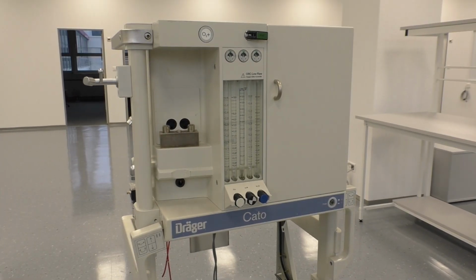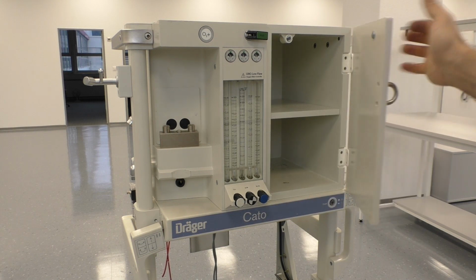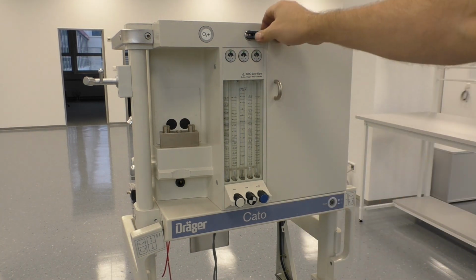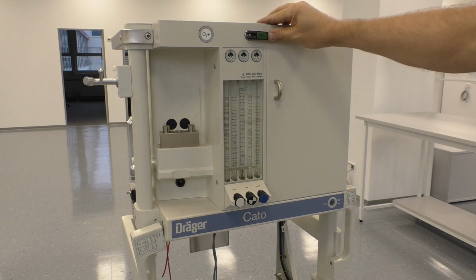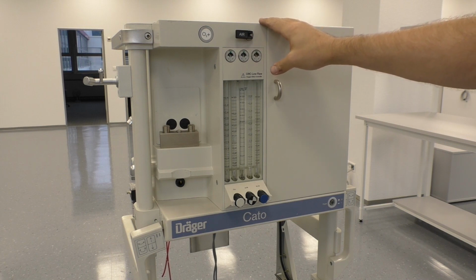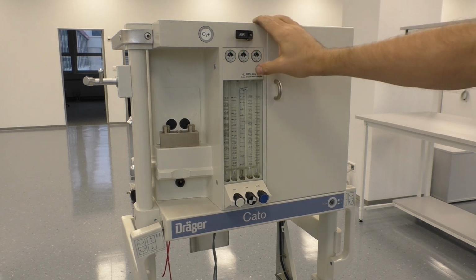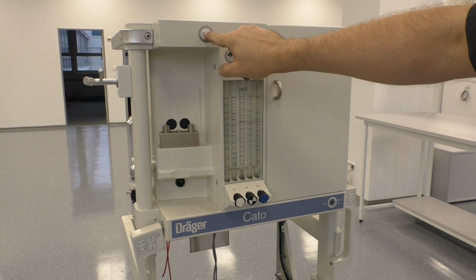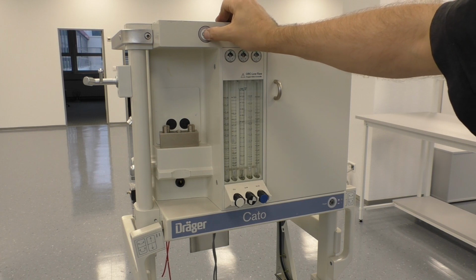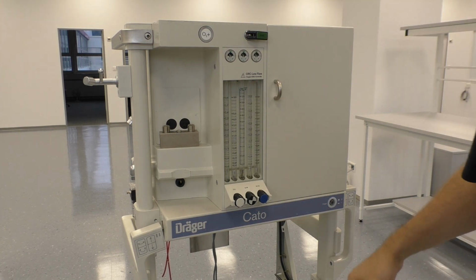Last part, the part up here. Here is a compartment for some accessories. Just a plastic door, maybe it could even be wood. There's a switch that switches from nitrous oxide to air. For example, when the surgery is over, to wake up the patients, you go from the narcotic to fresh air. Then you can give it some extra oxygen, maybe to wake up or for whatever reason.